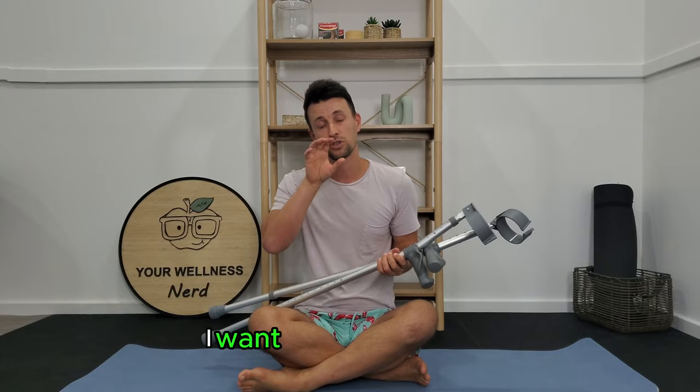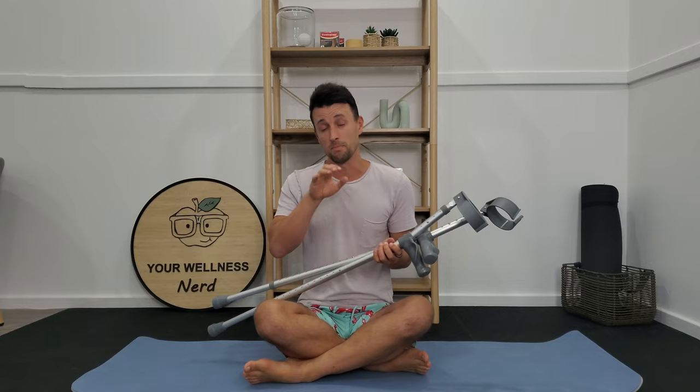G'day, so in today's video I want to show you how to correctly use elbow crutches, but more specifically I want to show you what you need to be thinking of while you're using them, how to fit them specifically to you and your body type, but most importantly what you need to be thinking of to optimize how quickly you can get off these as soon as possible.